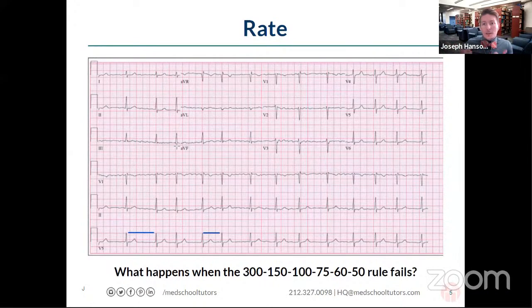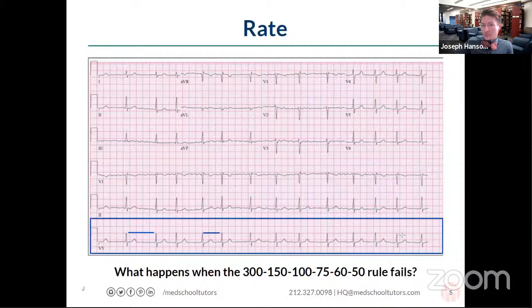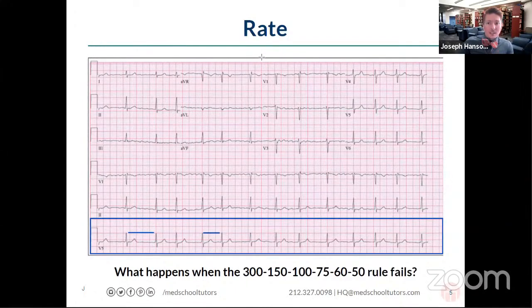So those are two mechanisms by which we can measure rate by looking at a rhythm strip. Typically on a USMLE-style question you'll only get one strip as your image. It would be rare to see a full 12-lead EKG, but we'll be proceeding as though we need to read a full 12-lead EKG for many of our questions tonight.